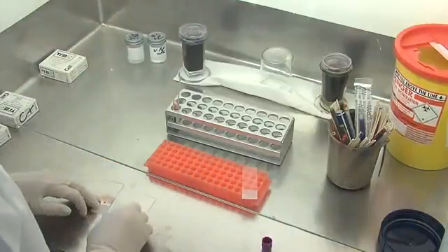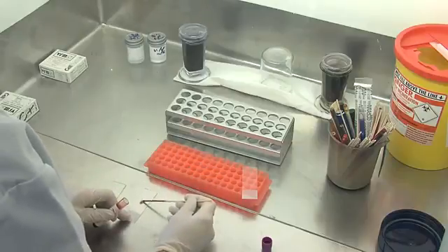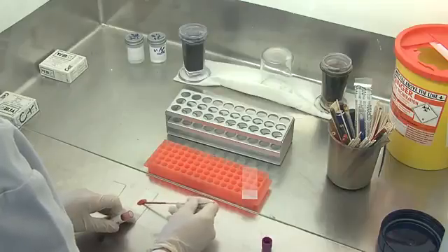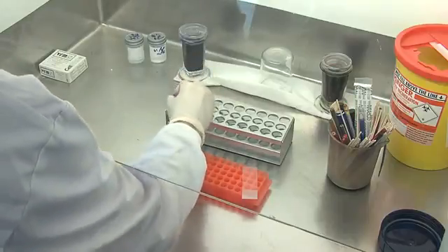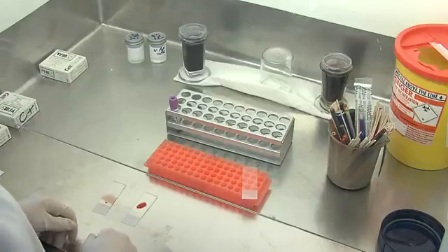We're then also going to make a thick film. This one won't be fixed when we stain it. For the thick film we use a bit more blood, so it's thicker. We're going to lyse the blood when we stain it, so you can look for lower numbers of parasites and also look for other stages or other species.